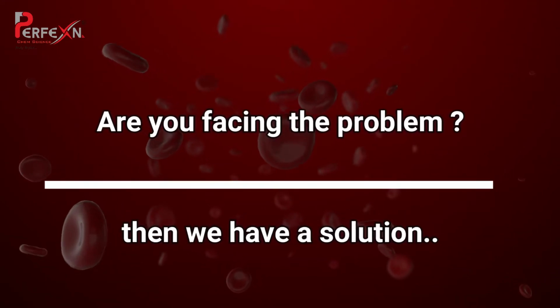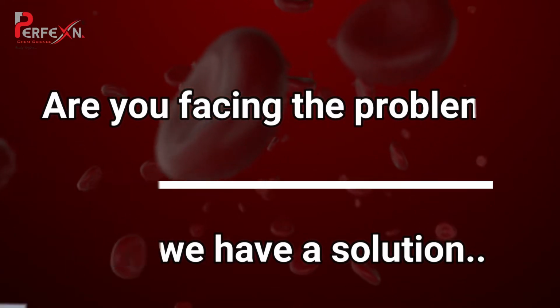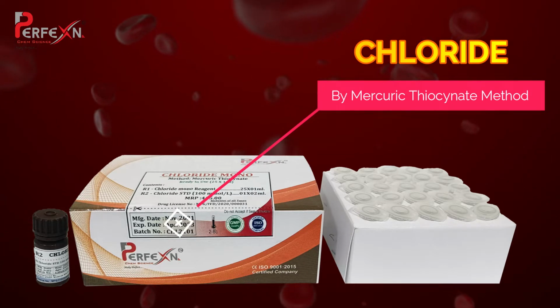Are you facing problems with kit settings in bioanalyzers or pathological laboratories? In this video, I will solve all your queries regarding kit settings. Hi guys, welcome to my YouTube channel. In this video, we will see how to set the chloride kit in every semi-bioanalyzer.